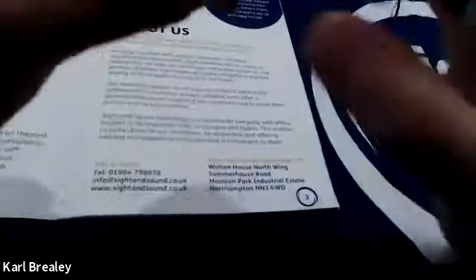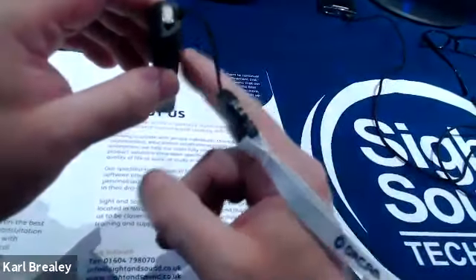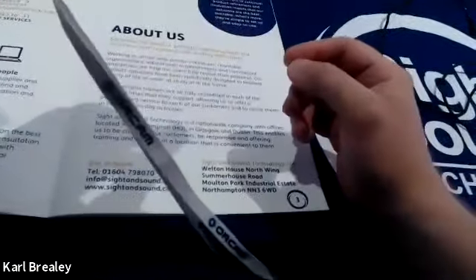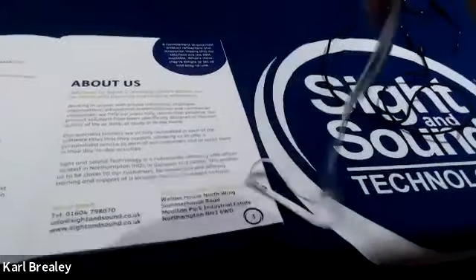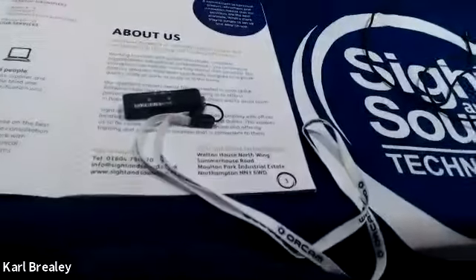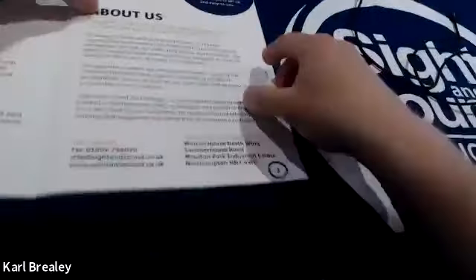So I'm not sure how this is going to pick up. I'm not going to put it on my glasses as yet because I'm trying to still keep it within the camera. So what I've done there is, the text seems upside down. That's because it says, "Rotate the page and try again." There you go. It's just told me the text is upside down, albeit it may be the way I'm holding it. So what I'm going to do is just clip it on the glasses. I'm going to lift the document or look down a little bit.